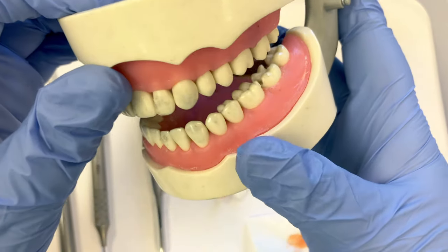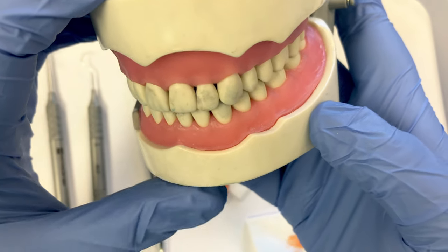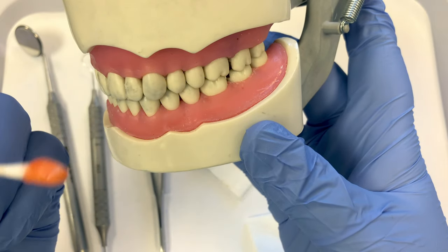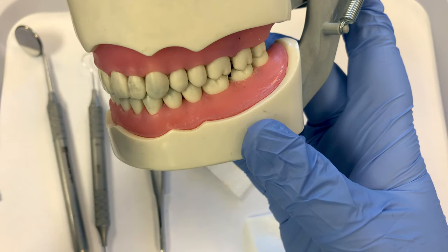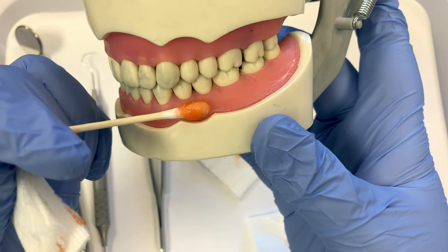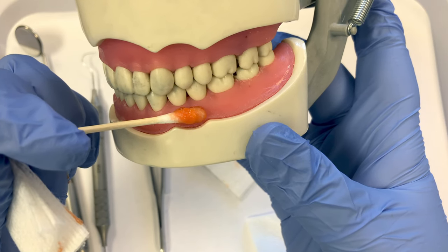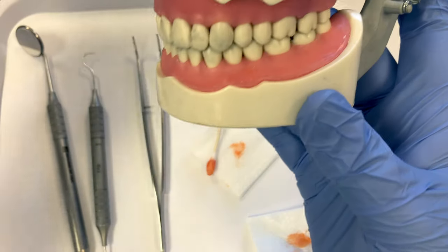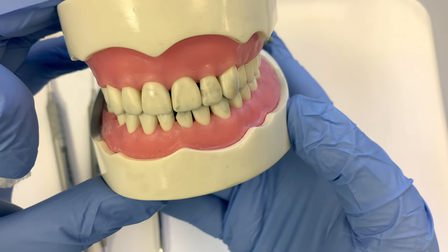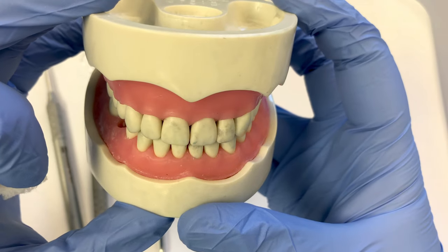For example, if given an incisive nerve block for number twenty-two, locate that area, explain to the patient you'll be placing a topical anesthetic to numb the skin before the doctor does the injection, dry the area, place the anesthetic, and wait three to five minutes. Placing the anesthetic requires us to understand the nerve supply to the teeth. Hopefully this video has been helpful and you feel more confident in placing topical anesthetic.